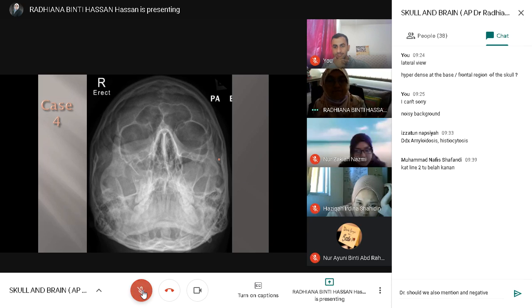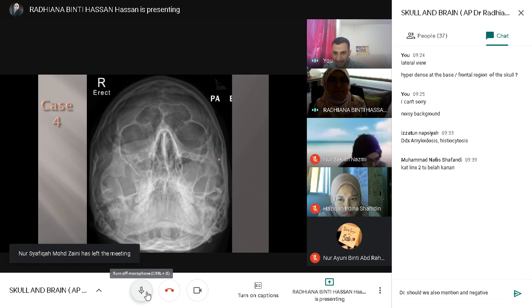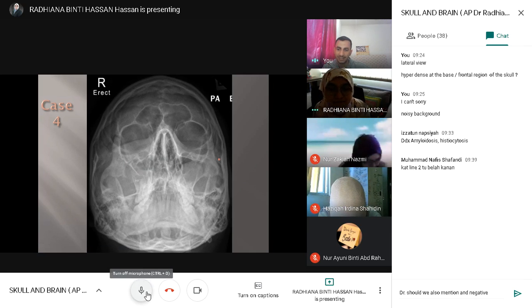What about the look asymmetry? Okay. So what do you think might happen?